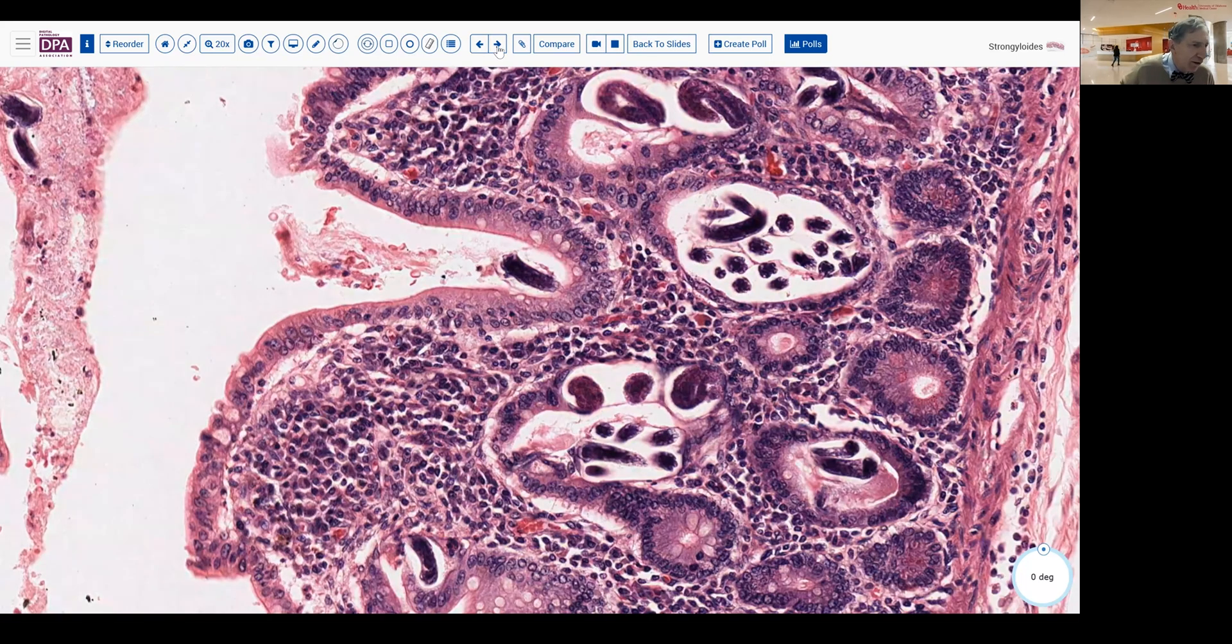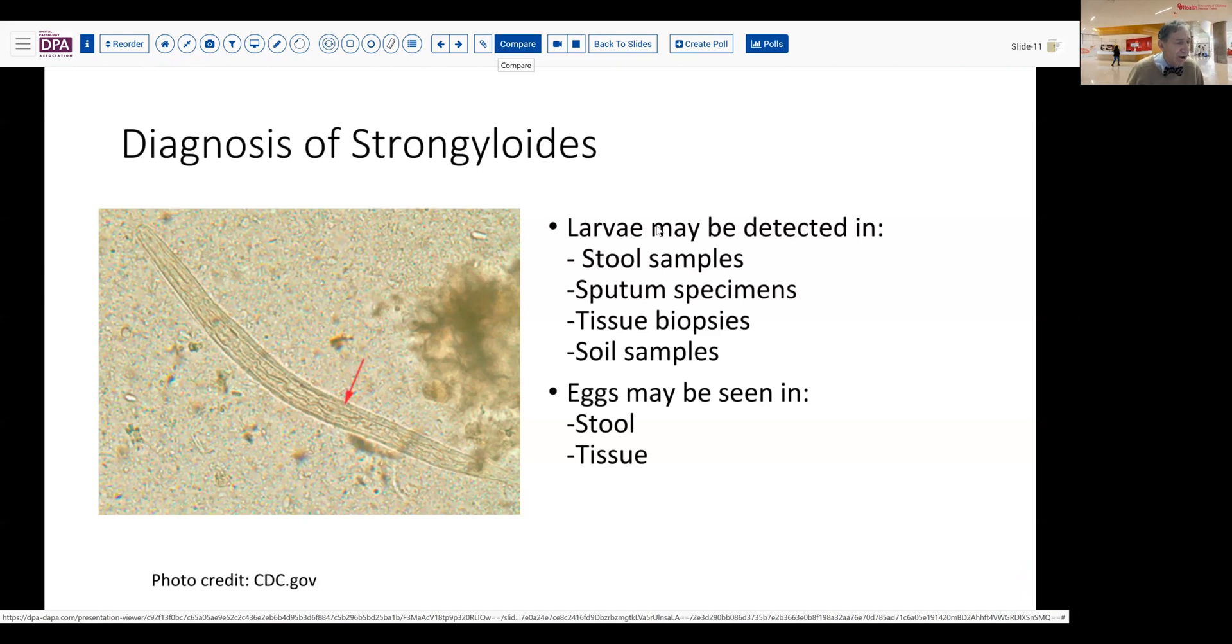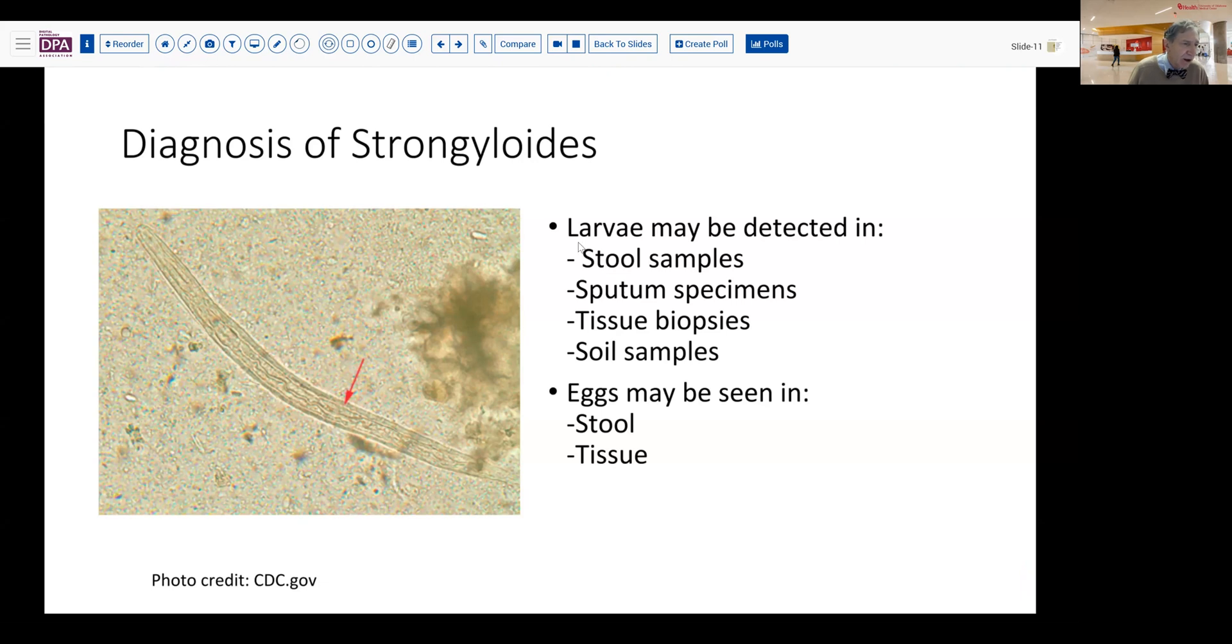Now, because of the life cycle of this organism, finding it in tissue is certainly not an infrequent way. But you can also detect the larvae within stool samples, within sputum samples occasionally, and in endemic areas within soil samples as well. The eggs may be seen on occasion in the stool if the infestation extends fairly distally, as well as in tissue.